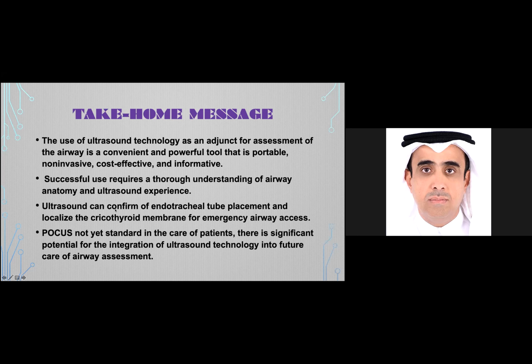It can also confirm endotracheal tube placement and localize the cricothyroid membrane in the emergency airway, and it should become a standard of care for patients. There is very significant potential for the integration of this ultrasound technology in the future care of airway assessment.